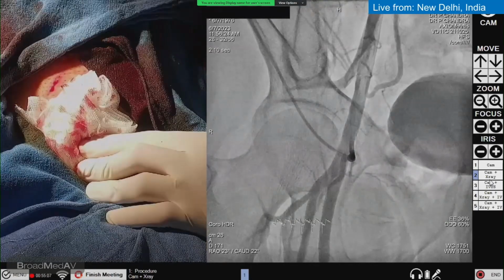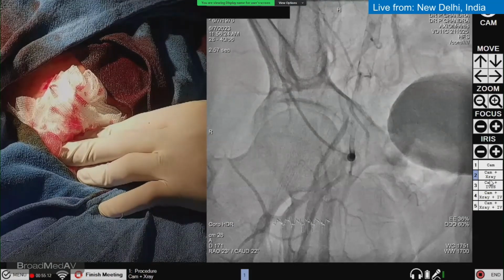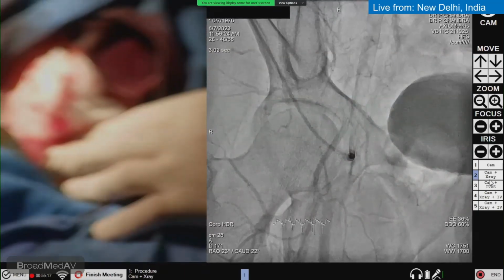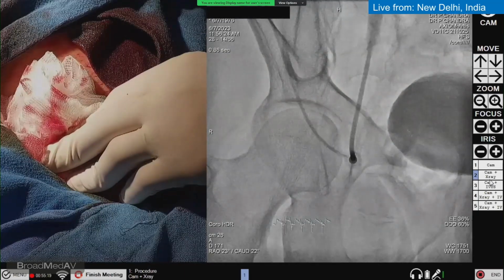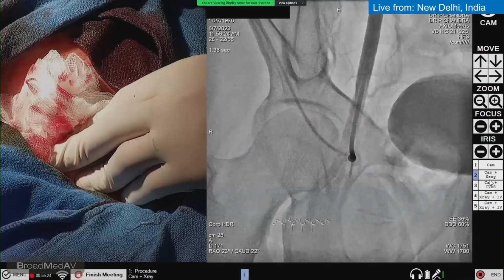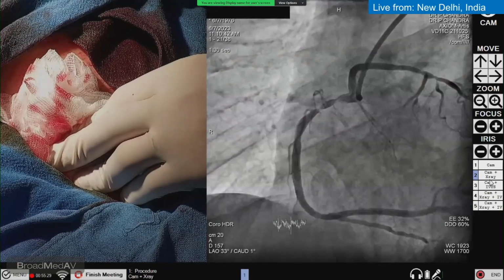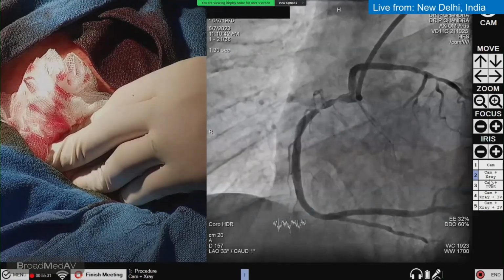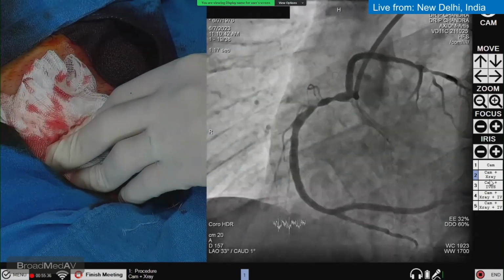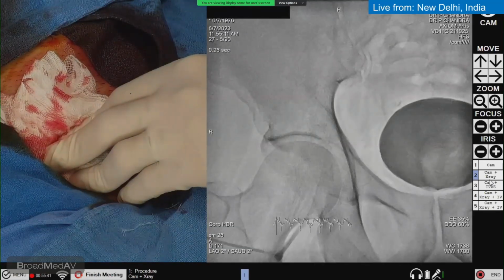That's all. Okay. So thank you very much. I think we demonstrated an anomalous coronary artery, which is a left main anomalous coronary origin from the right sinus, and the lesion was at the bifurcation, which we treated with a drug-eluting balloon and a cutting balloon without any dissection, no residual. And the right coronary, which was the dominant vessel, was simply treated with a 4.5 size stent because IVUS imaging showed it is a 4.5 vessel. So thank you very much. Hope to see you back again at 4:30 today.